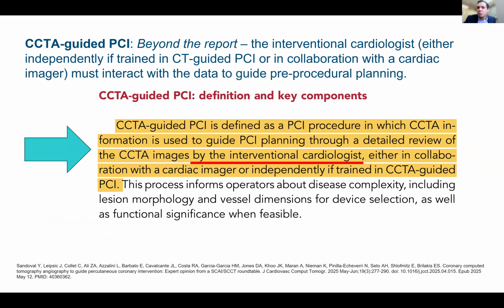So what is CT-guided PCI? It's a catchy term, but you may ask what exactly it is. I want to highlight the underlined section here. I'm an interventional cardiologist at Minneapolis Heart Institute, and this is shifting us from just looking at the PDF report from our imagers that says consider a cath or cath recommended, to now saying, I want to interact with those images for PCI planning.